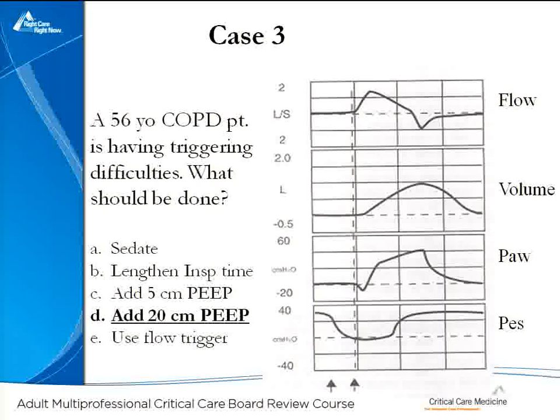In a normal person, or at least a person with normal airways, the drop in pleural pressure is transmitted to the circuit pressure almost instantaneously. I even gave you a trivia question. It moves at the speed of sound, which is pretty darn fast. Okay? So this lady, in contrast, notice the effort begins right here, and there is a noticeable delay in the ventilator circuit pressure falling.